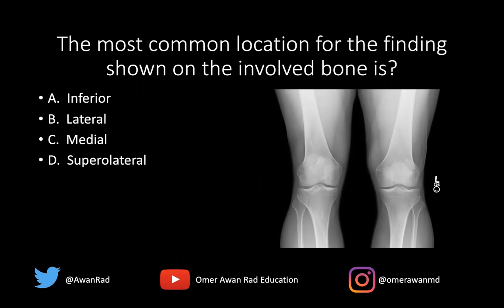If we take a look here, the finding that we're seeing is a bipartite patella. We have an unfused ossification center right here along the patella, and it's oriented superior laterally. This is superior, this is inferior, this is medial, this is lateral — and this unfused ossification center is superior lateral with respect to the patella.